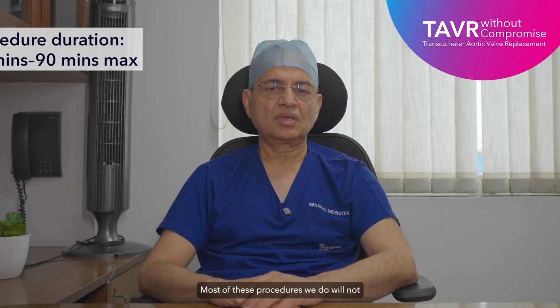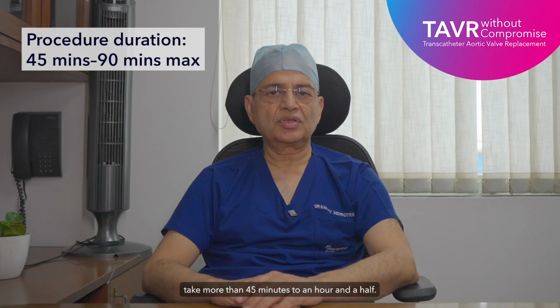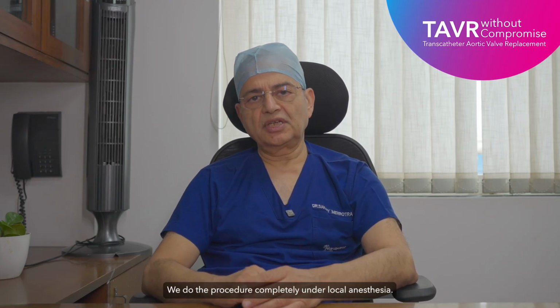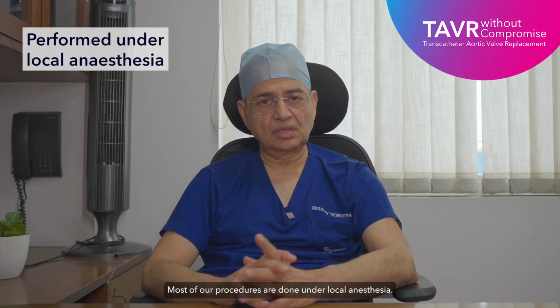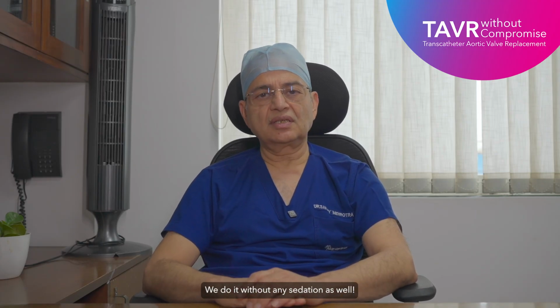Most of these procedures we do will not take more than 45 minutes to an hour and a half. The procedure is, of course, done under local anesthesia. Most of our procedures are done under local, and we do it without any sedation as well.